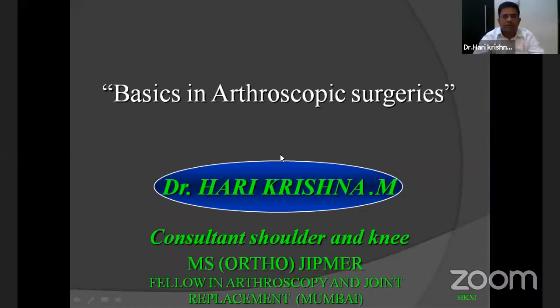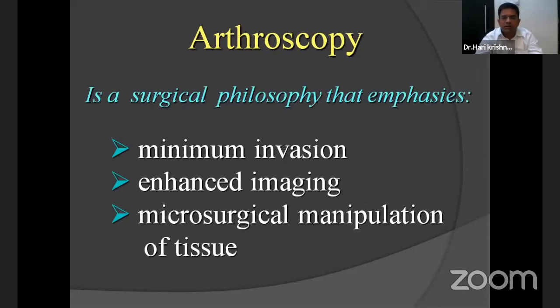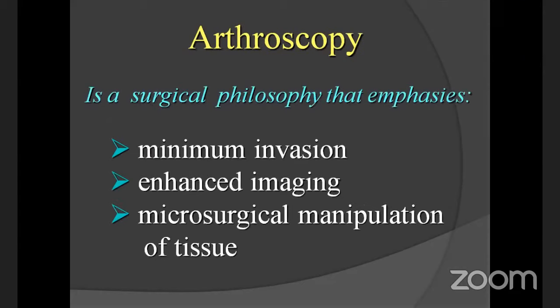Good evening, everyone. Endoscopic surgery is a surgical philosophy which we do with less invasive techniques, like minimal keyhole surgeries. Arthroscopy is the keyhole surgery which we do in the joints. Arthroscopy is a surgical philosophy that emphasizes minimal invasion, enhanced imaging, and microsurgical manipulation of the tissues.